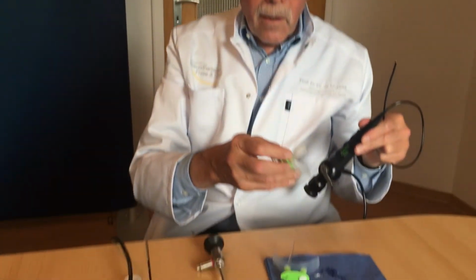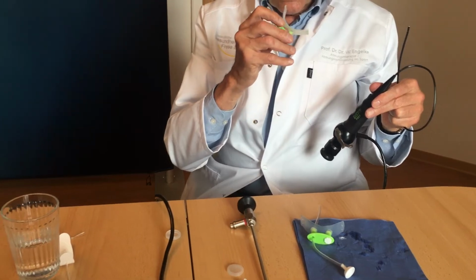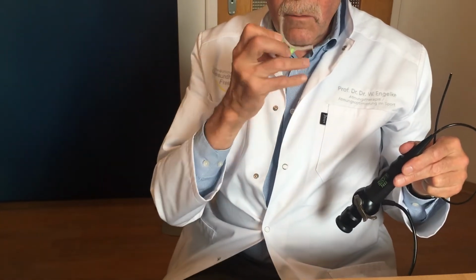So to repeat the use of endoscope and the vacuum activator, I'm going to place the activator now and place afterwards the endoscope.